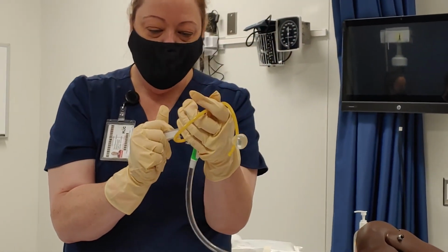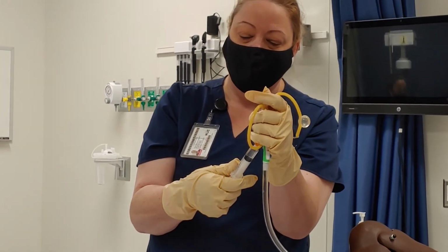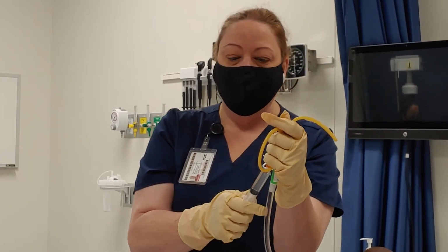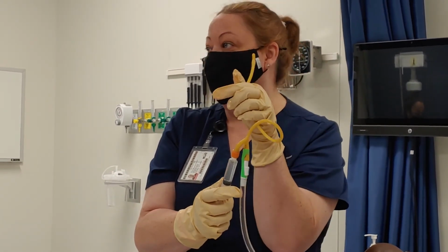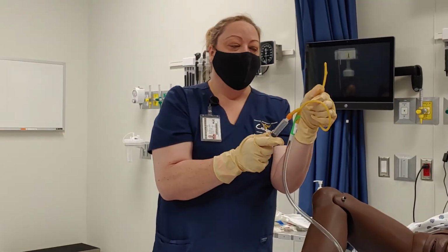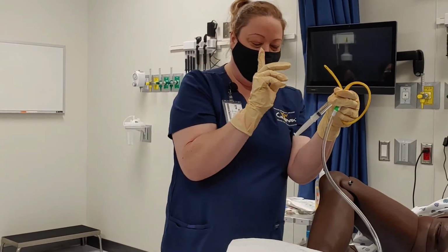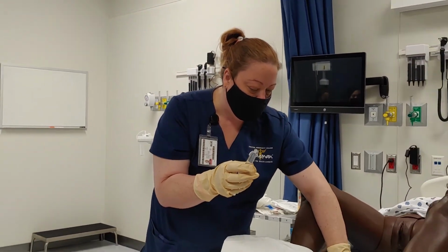Now, I will tell you, when I worked in a nursing home and in the hospital, when I would have some people that weren't very lucid, so they didn't have all their faculties about them, they pulled it out with the balloon in place. Can you say ow? All right. Yeah, so not ideal, not something you want to do. You want to talk about pain? Yes, that one will cause you pain. All right, so that's all there is to doing this.